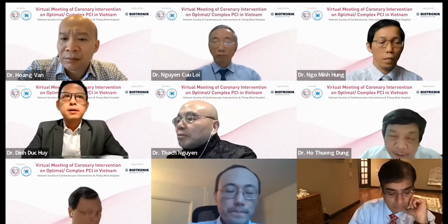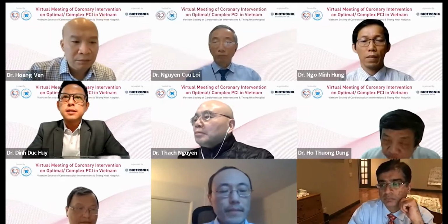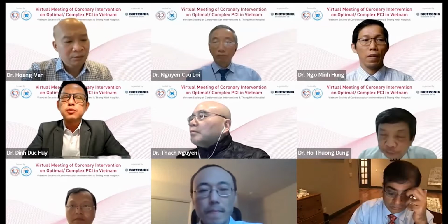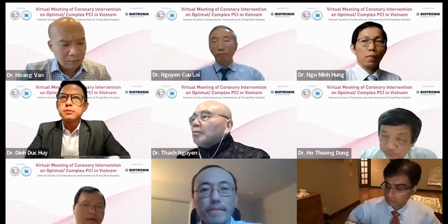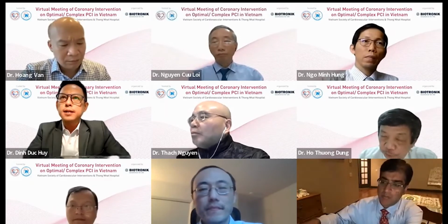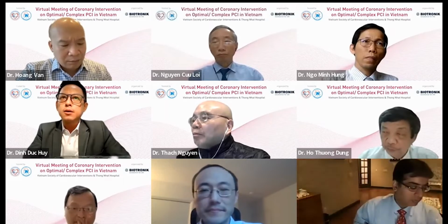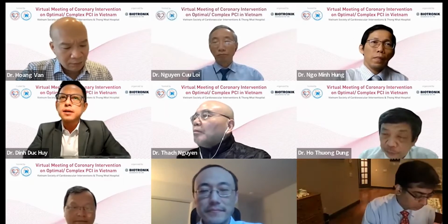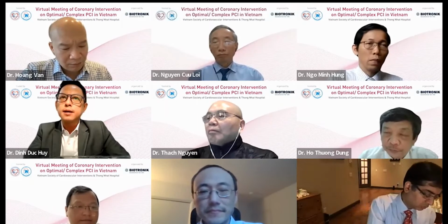Thank you, Michael. I want to hear the opinions from Dr. Vũ regarding the imaging technique for small vessels. In the first case, Professor Dũng showed a case where OCT could not be done for the left main, LAD, and also the left circumflex. Do you think IVUS can help in those cases? Can we use IVUS to define the real diameter of the left main and LAD, and also the anatomy of the bifurcations of left main diagonal, LAD diagonal, and left main left circumflex?